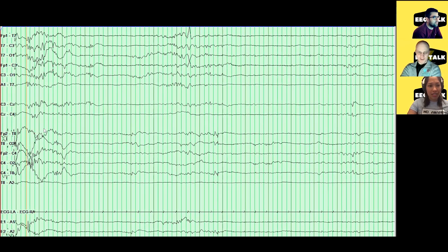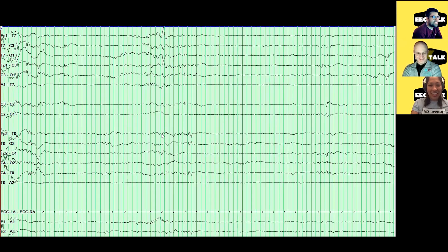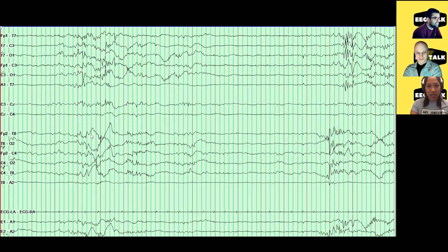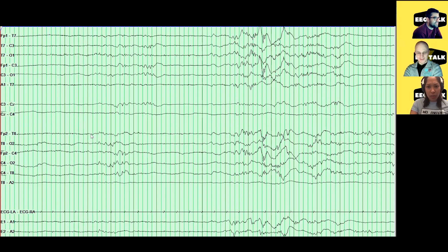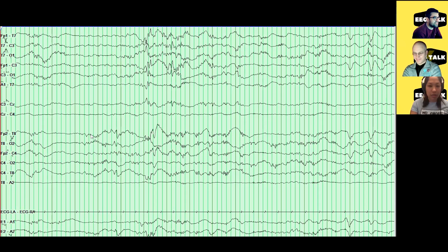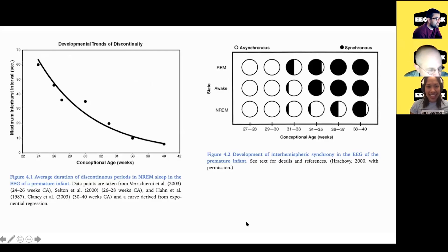Oh, yeah. So how old is this kid? This kid is 30. Don't tell her. Don't tell her, Fabio. Don't tell her. I won't. Actually, the interval's longer. One, two, go ahead. Well, there's a little between, but they go up to maybe, when I reviewed this record for real, like up to 12 seconds, maybe even 14. Yeah, this kid had discontinuity during sleep up to around 12 to 14 seconds.